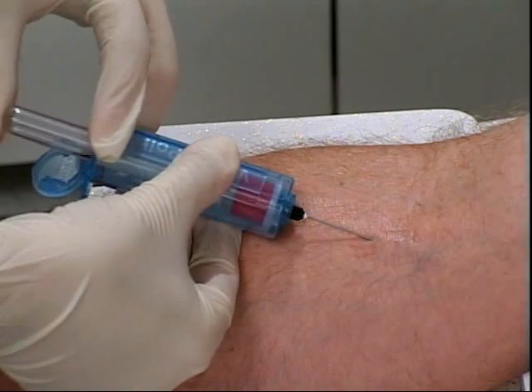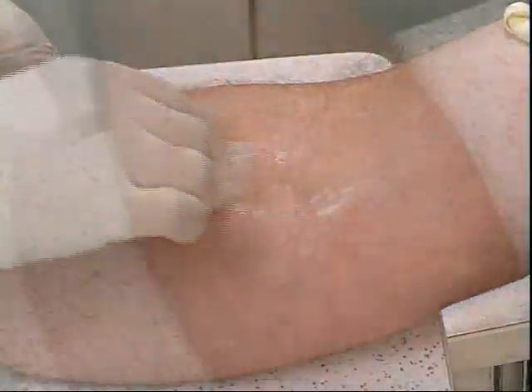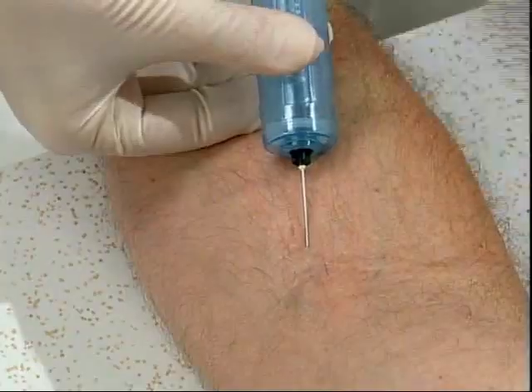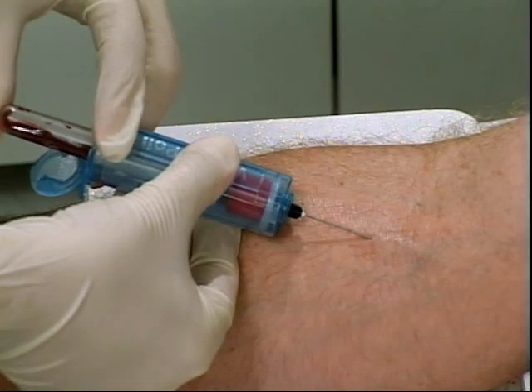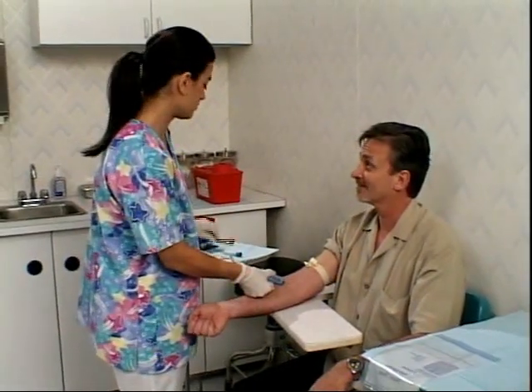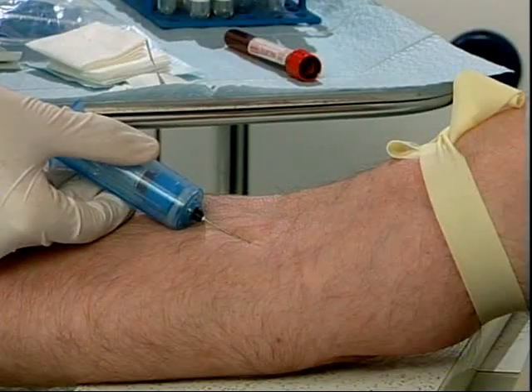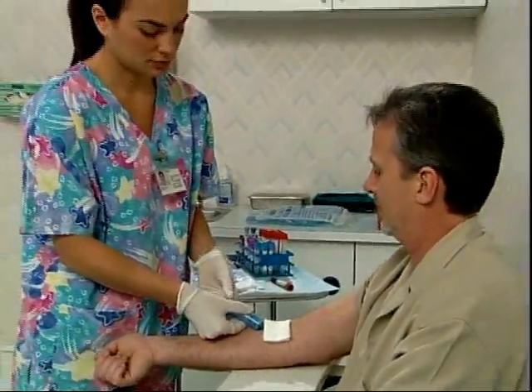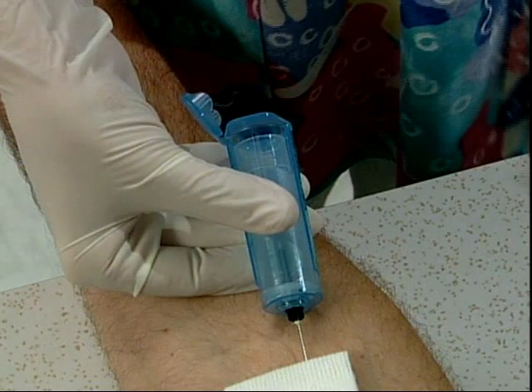VanishPoint tube holders are easy to use. Securely thread the blood collection needle onto the tube holder. Perform the venipuncture following your facility's protocol. Insert the appropriate blood collection tube, advancing the tube to initiate blood collection. Repeat with additional tubes as necessary. As the last tube is filling, remove the tourniquet and place gauze at the venipuncture site. When filled, remove the last tube. While the needle is still in the patient, close the end cap.